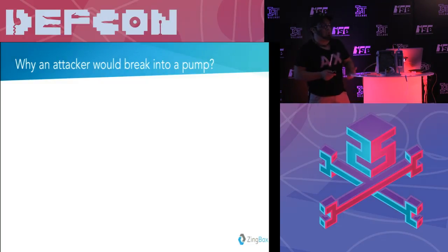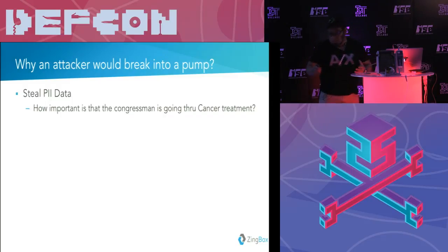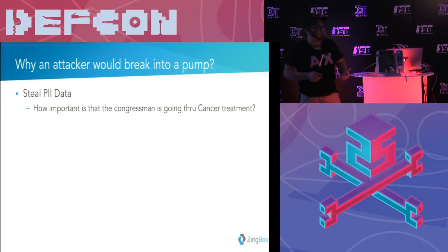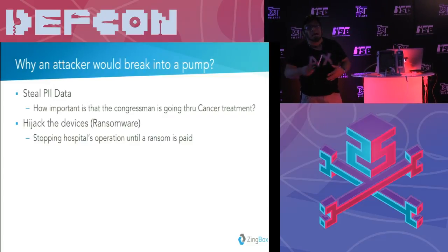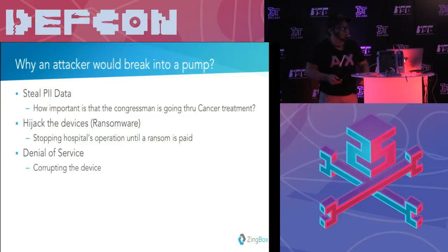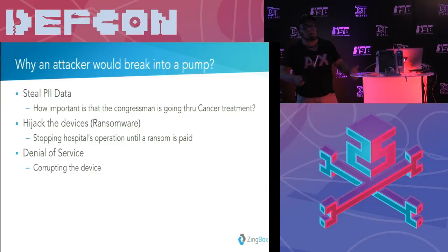So what is the attacker's goal here? Obviously, if there is sensitive information inside, like PII data, like a congressman who is dealing with cancer, or unfortunately a congressman dealing with brain cancer right now, you don't want others to know about that. But if someone breaks into this, they can use it in a malicious way. Hijack devices, of course, this can also be ransomware-based. It's running on Linux, we will see details of that. You can hijack it, you can ask for ransom, and obviously you can disrupt it so it doesn't work anymore, the patient doesn't get attended, and it's bad.